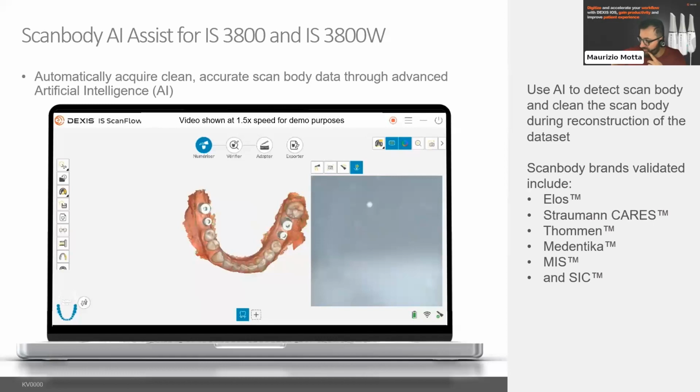As we mentioned in the previous webinar, the scanner, the Dexis IOS, uses structured light technology that technically does not need any calibration. But, for example, a really bad or deformed tip, because you sterilized it too much over the 60 or 110 times that we recommend, or there are a lot of factors that can affect your scanning.